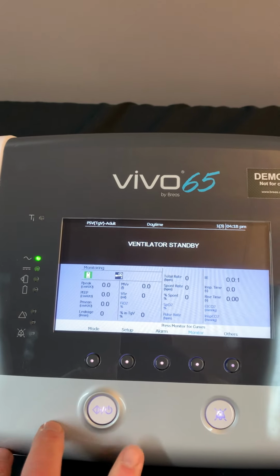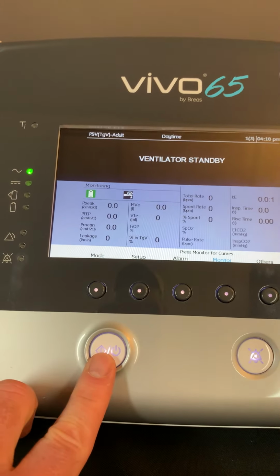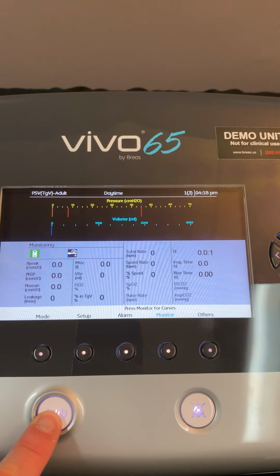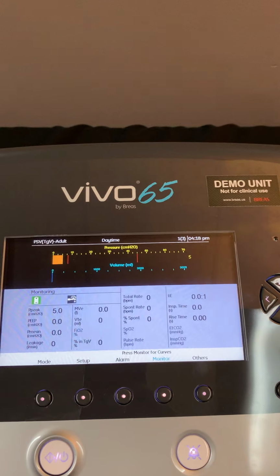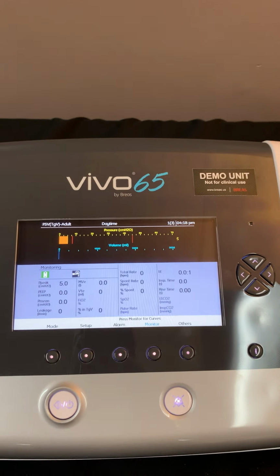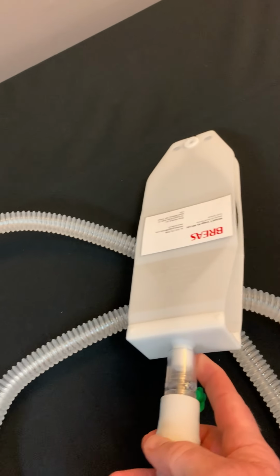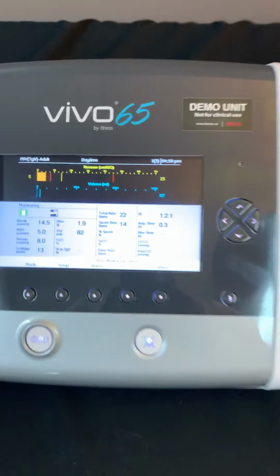We're going to go ahead and start the ventilator up. So this is our standby button. By pressing and holding that standby button down for about 4 seconds, you'll see that the treatment is now started on the device. Okay, so I've got treatment going into the lungs. I'm just going to set that down there on the floor.